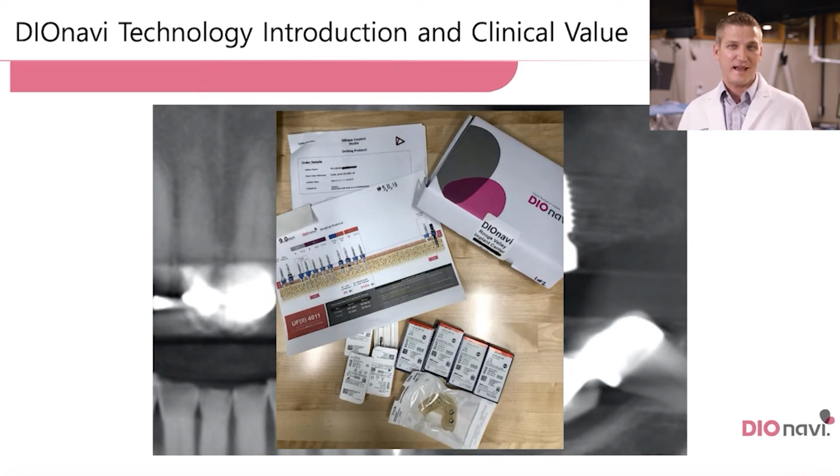What I love also with DIOnavi, it's this idea of a case in a box. And so one case gets sent to me, I open it up, it has my implants, my guides, my healing abutment, or my custom abutment, or my anatomical abutment, with a prosthetic crown, with my drilling protocol, all in one box. In terms of organizing our implant cases, coordinating with this lab, or that lab, or this manufacturer, this really streamlines it. There's only one place, DIOnavi, I talk to them, and they get the whole thing from A to Z figured out for me, and it just makes it a lot easier for organizing our cases.